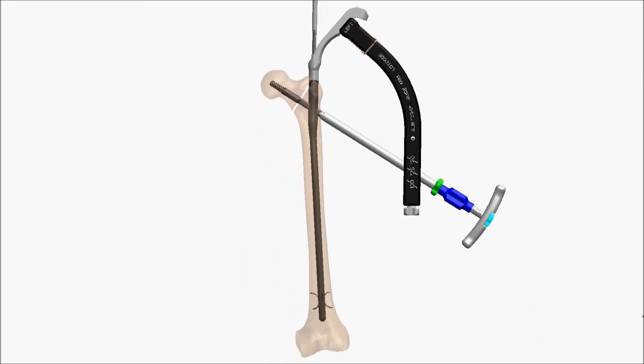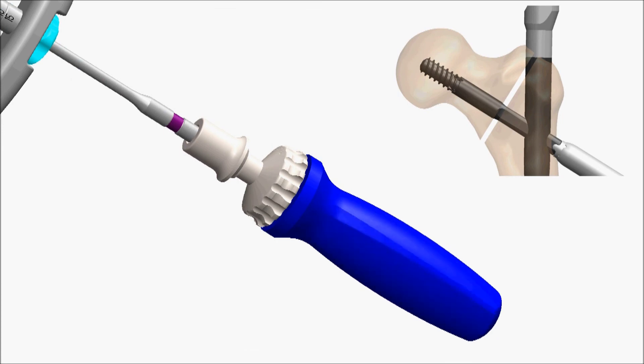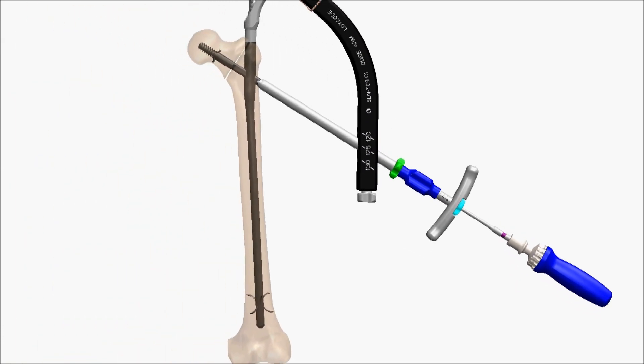Insert the lag talon deployment driver. Turn clockwise to deploy the lag screw talons. The extent of talon deployment is at the discretion of the surgeon and should never be done using a powered instrument. See the technique guide for more details.